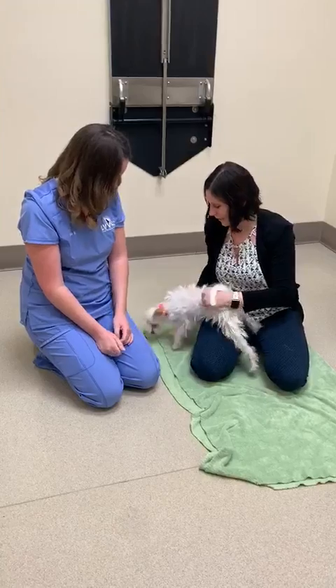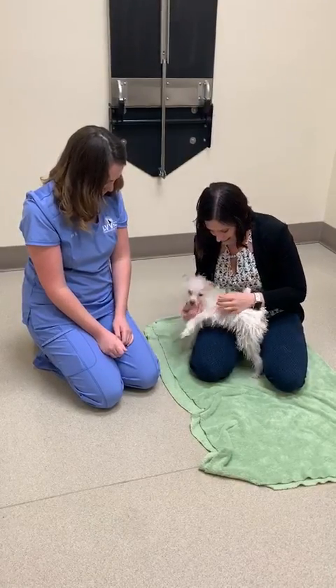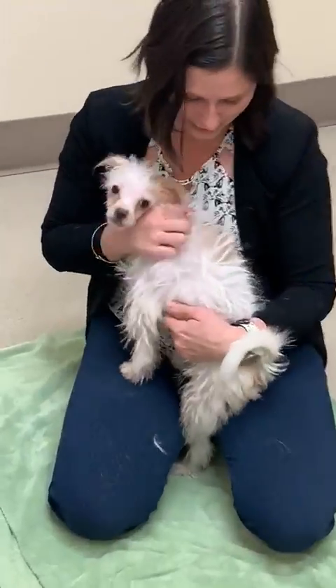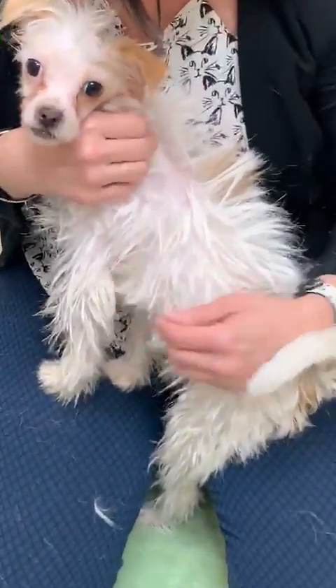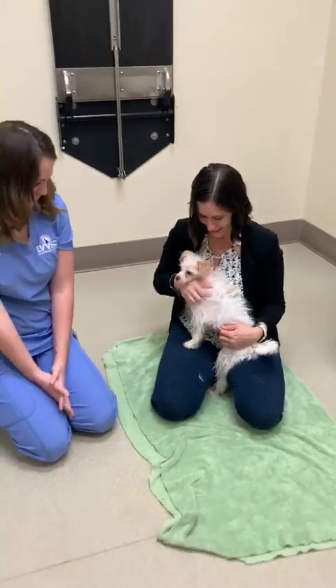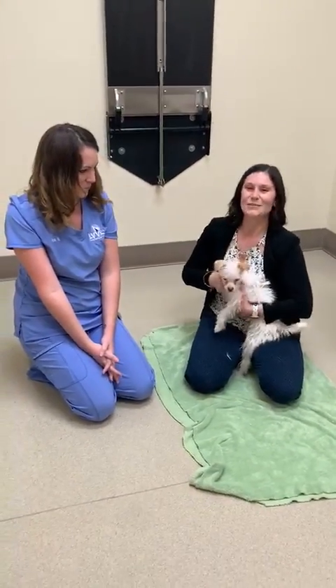She does have a tiny little spot of blood, as you can see. So if you see that, that's pretty normal too — I wouldn't be too worried. White dogs tend to have more bleeding spots, so I wouldn't be worried about that. Thank you guys for watching!